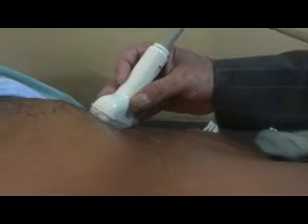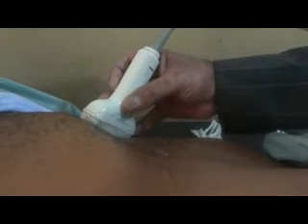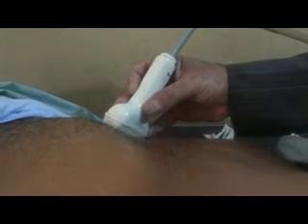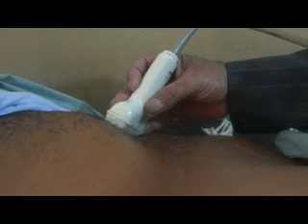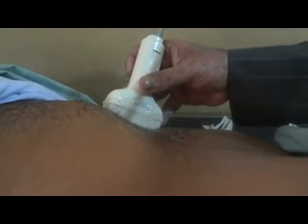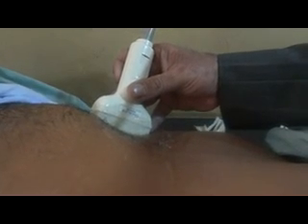Now again, I am going to place the probe perpendicular at the mid subcostal region, angle it as per the requirement, and then pivot it.